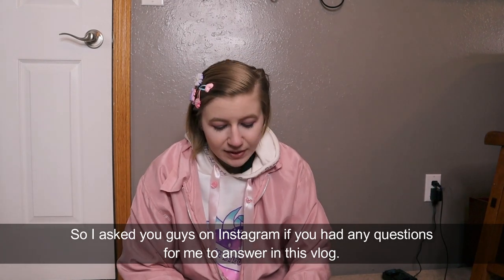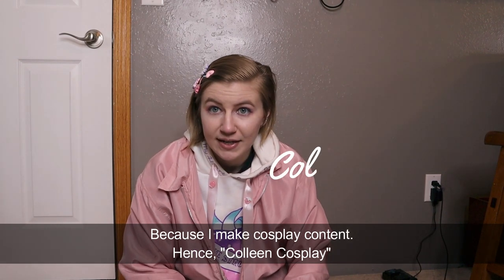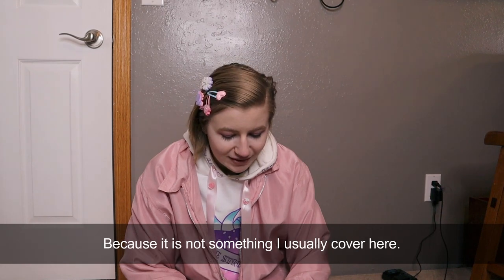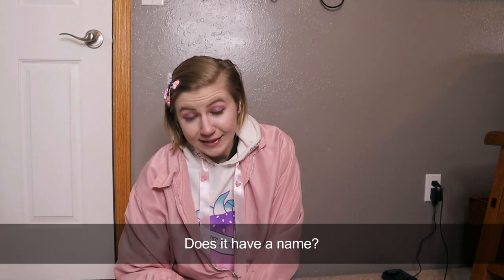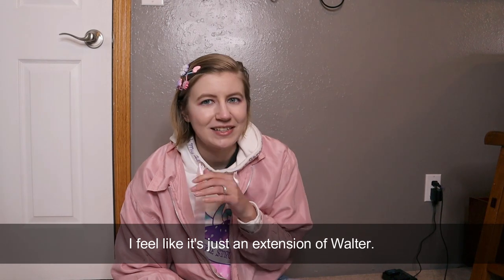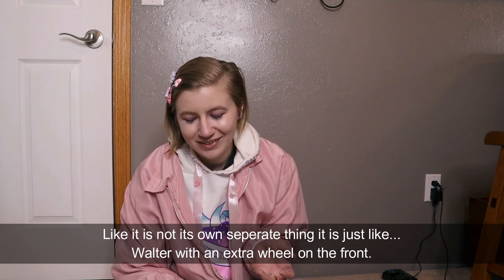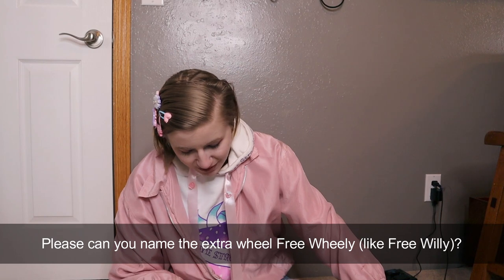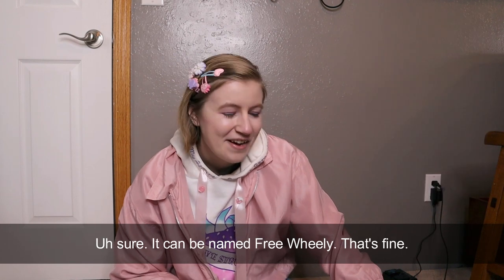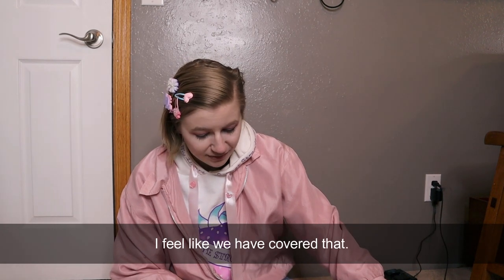I asked you guys on Instagram if you had any questions for me to answer in this vlog, because I make cosplay content. So whenever I talk about stuff like this, there's usually a lot of people who have questions because it's not something I usually cover here. Does it have a name? I have not named the freewheel. I feel like it's just an extension of Walter — it's not its own separate thing, it's just Walter with an extra wheel on the front. Someone suggested naming the extra wheel 'Free Wheelie.' Sure, it can be named Free Wheelie. I feel like the majority of questions were just what is it and what does it do, and I feel like we've covered that.